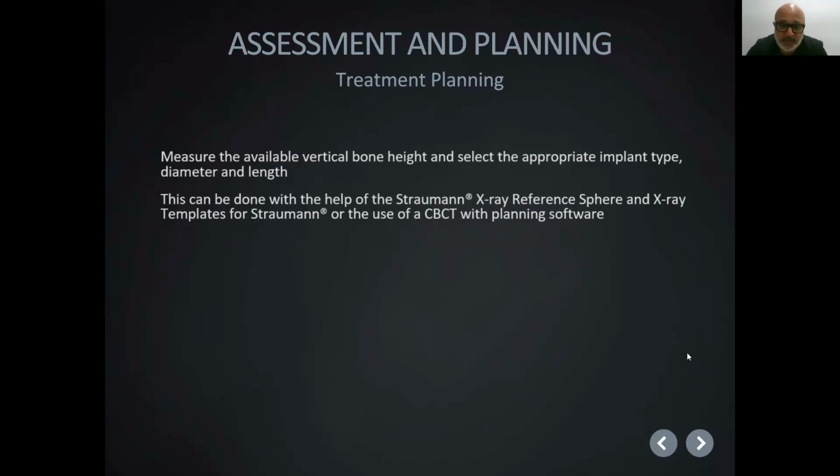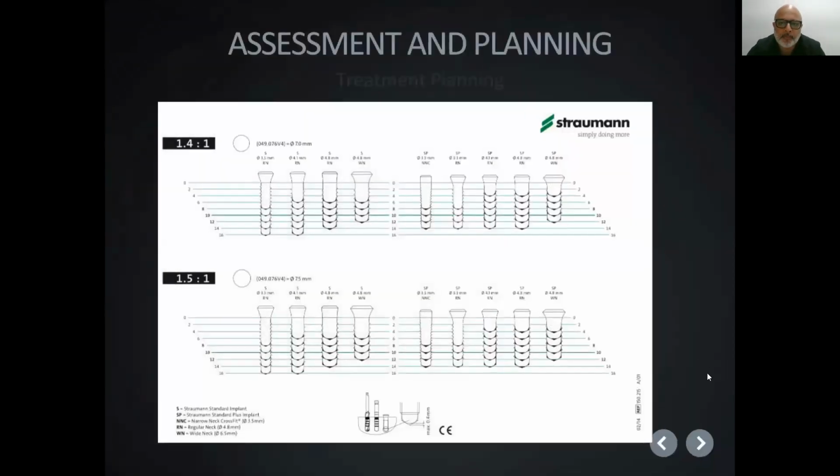If you see a patient with a missing tooth who coincidentally wasn't sent for a CBCT, you can have a practice. But if they think about getting an implant, there's an indication for it, or they've had one, then why not have a look? And I'll show you some of the software you can use as well.